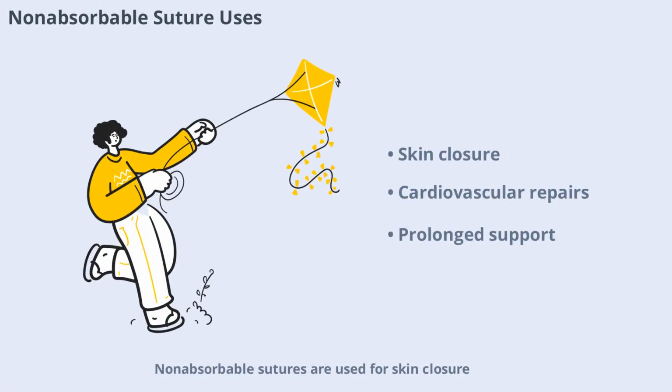Nonabsorbable sutures are used for skin closure, cardiovascular repairs, and other situations requiring prolonged support. Their durability ensures that the wound remains securely closed until healing is complete. These sutures may need to be removed after healing or left in place permanently, depending on the clinical context. Their versatility makes them indispensable in many surgical procedures.